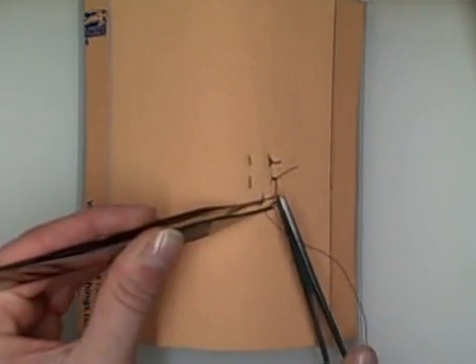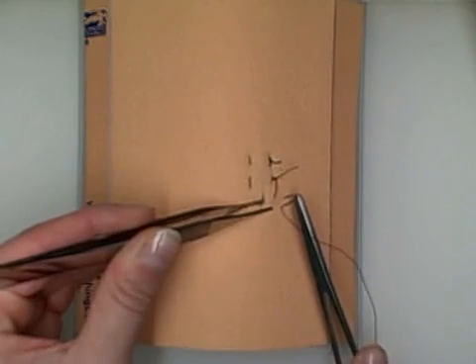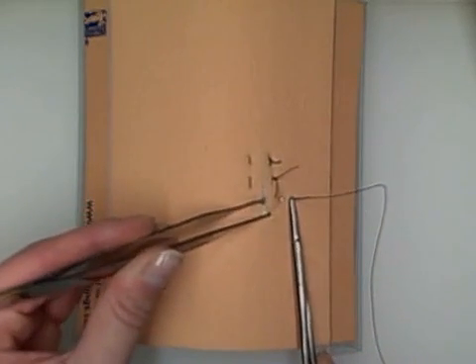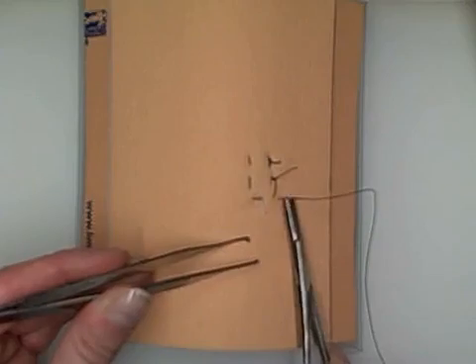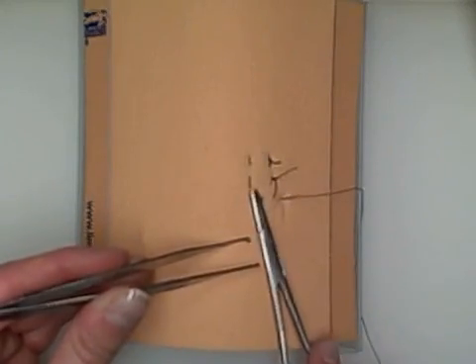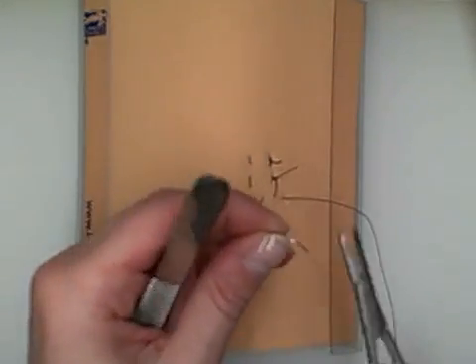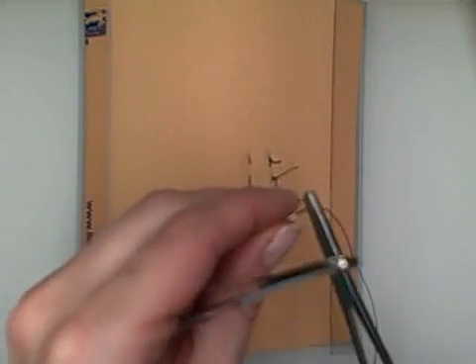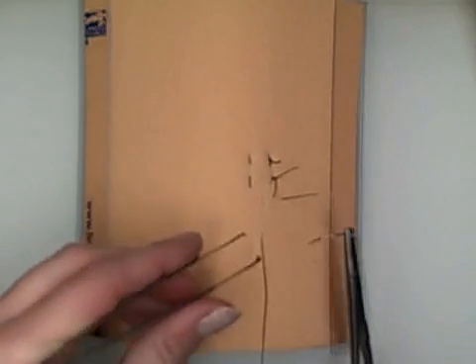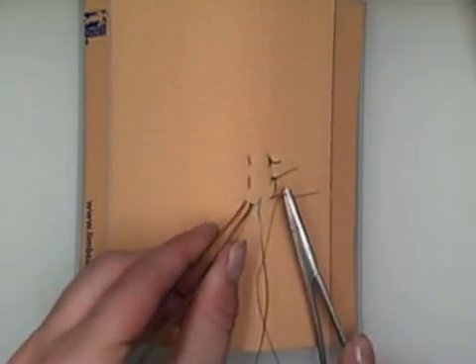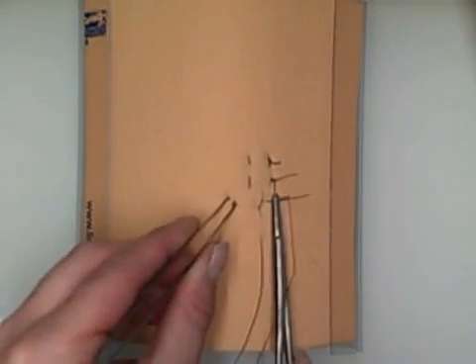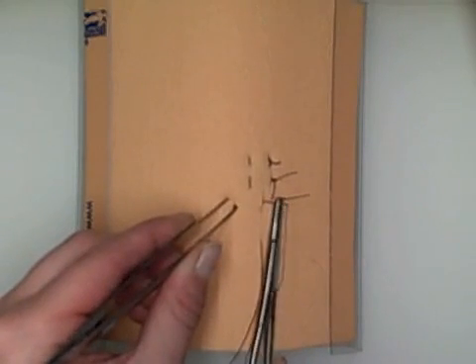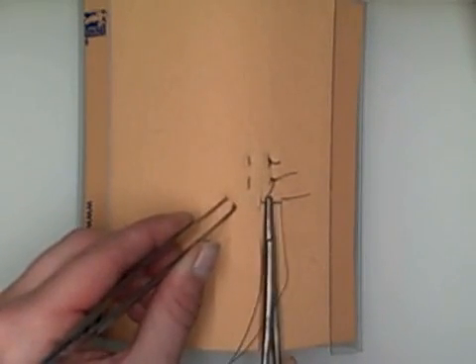And we're going to start, we're going to take a nice deep bite. The vertical mattress suture is actually excellent for incorporating a large amount of tissue because you take these big, deep bites. So it actually gives you a little bit greater tensile strength on your wound closure.